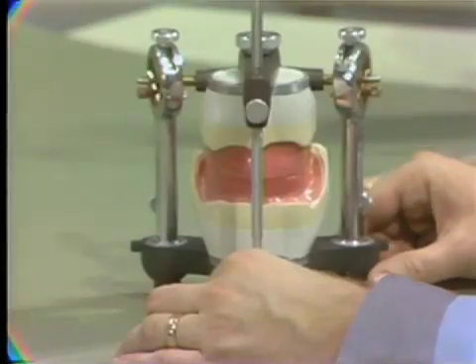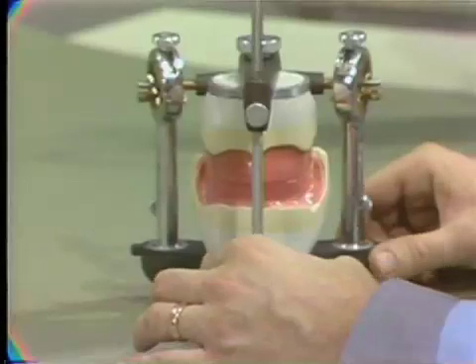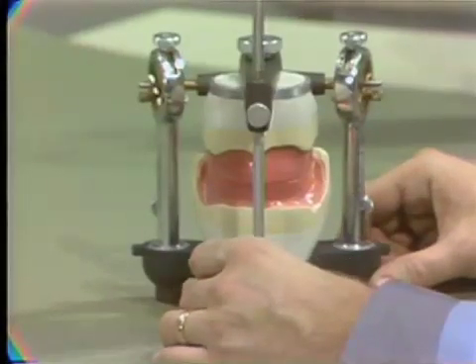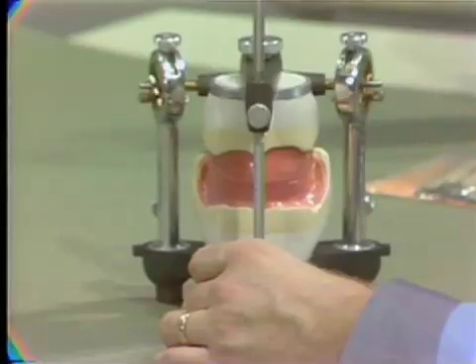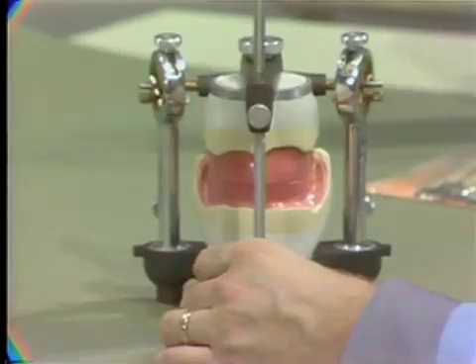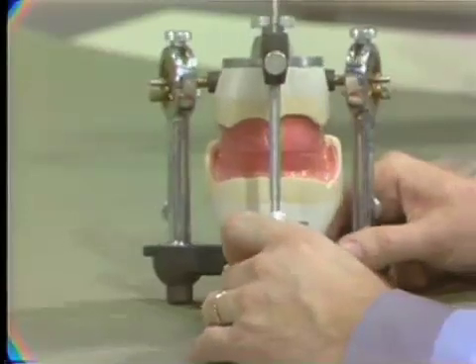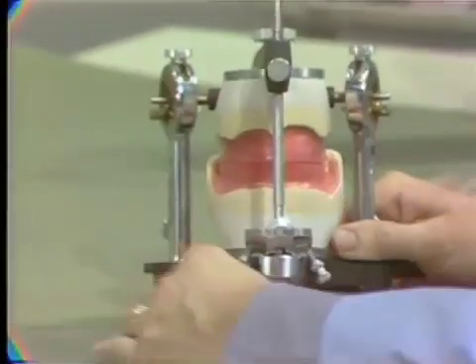And although there is asymmetry in all patients, we have guidelines such as philtrum of the lip and so forth to determine the eventual position of the teeth. On the articulator, we have to do this a little more arbitrarily so that everybody has the same midline. I suggest this method.